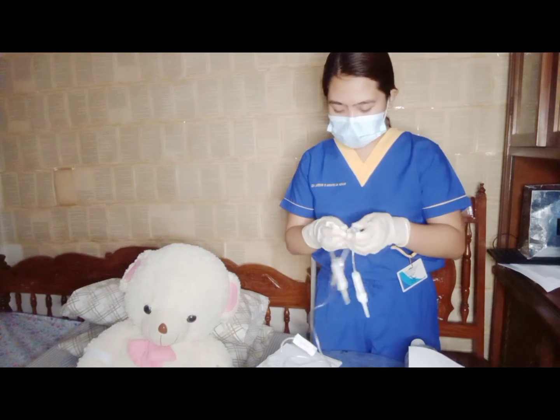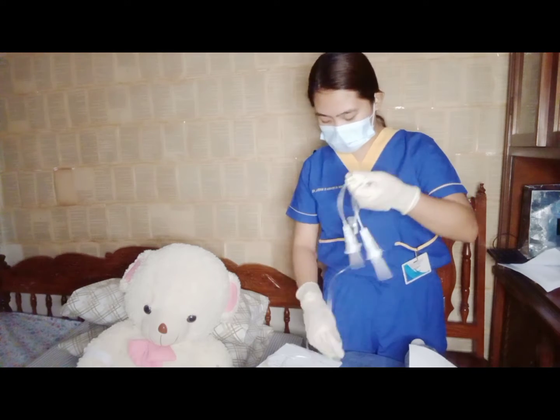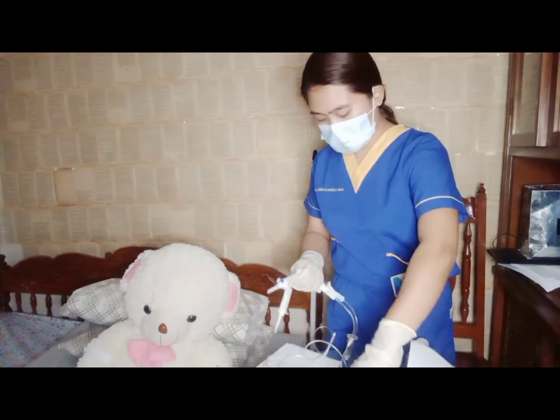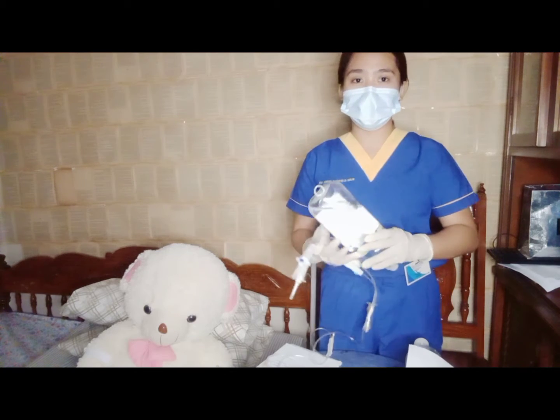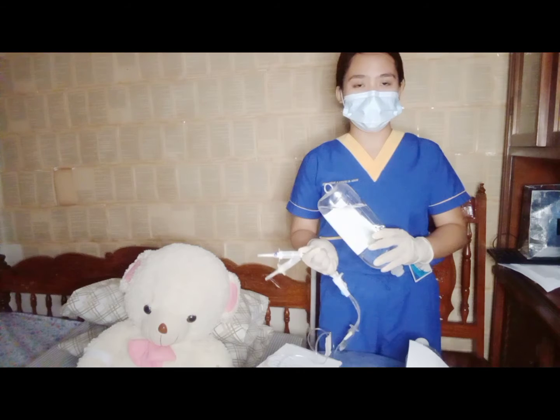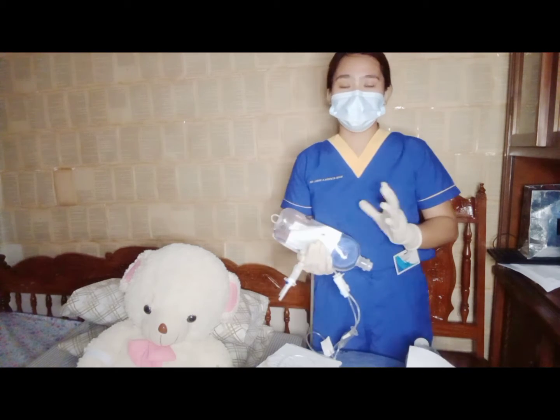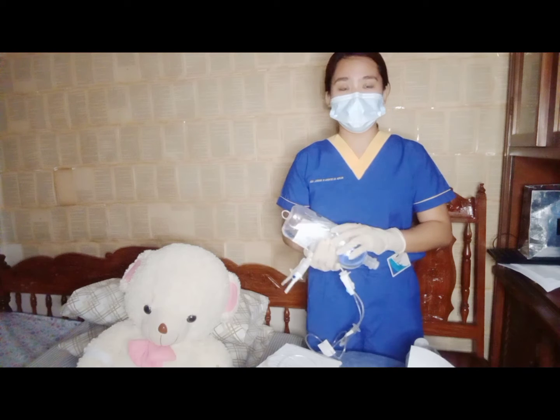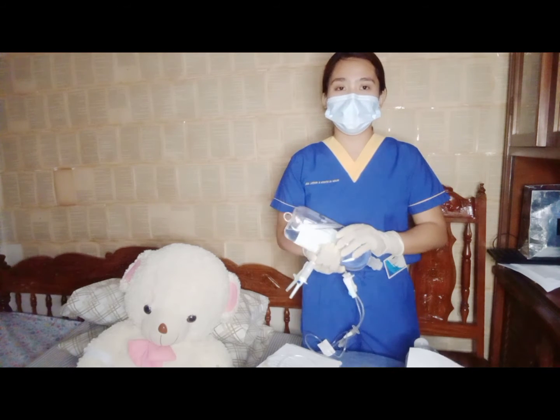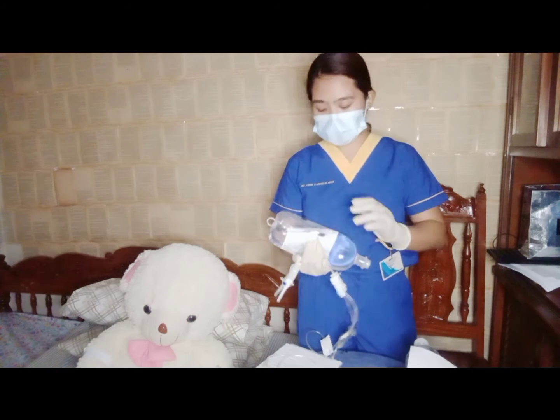We need to close the clamps, all the clamps. So, this is a normal saline 0.9% solution. This is a solution choice for the blood transfusion. Hindi po natin ginagamit ang mga solutions that contain dextrose because this may lead to hemolysis or the clogging of the red blood cells or the blood.